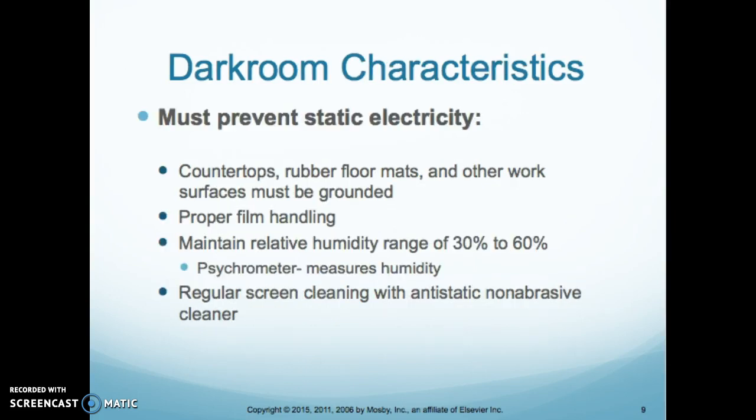So static. Being down here in Southern California with the Santa Ana winds, we have to deal with static. Static electricity is just a part of the job, and there are ways to reduce it. So we use a certain type of countertops, we use rubber floor mats, and everything is grounded. And when we are pulling a film out of the film bin, we need to pull it out nice and slow. If we pull it out fast, it's going to create static electricity, and it's going to expose your film, and we'll show you what those artifacts look like when we get to film.